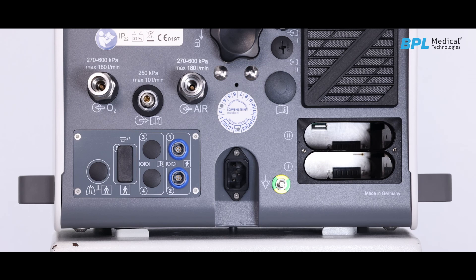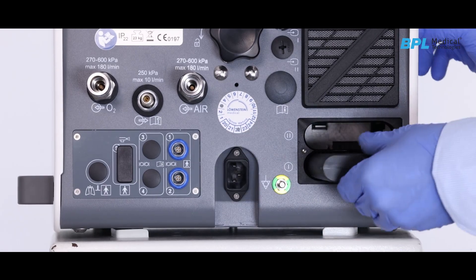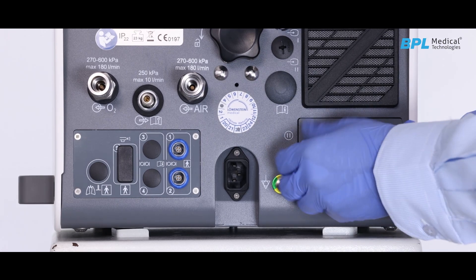The hot swappable 2 battery compartments enable longer backup time. Supplied with a lithium battery, its backup time is 2 hours on a fully charged battery.